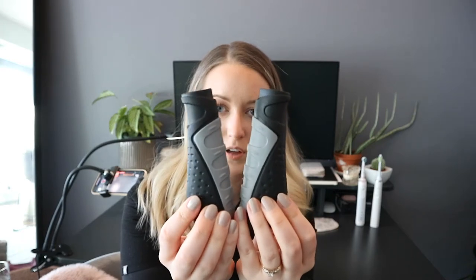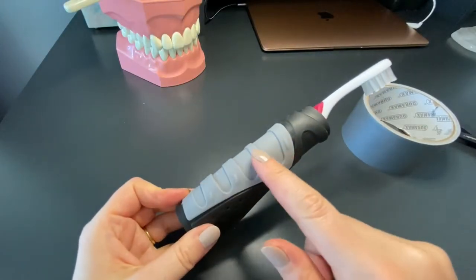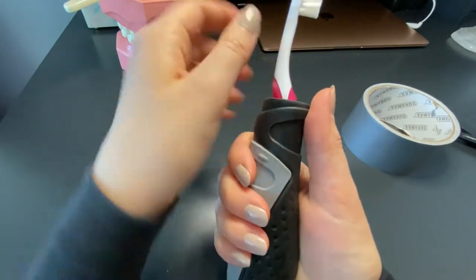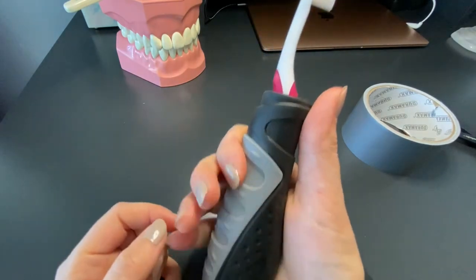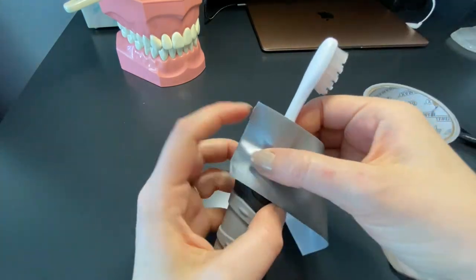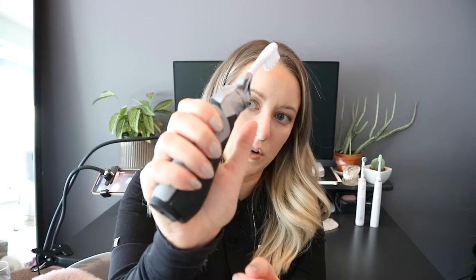Another great thing found at the dollar store are bicycle handle grips. This is perfect — it's made for a hand and you can just take your toothbrush and stick it in there. You might have to tape the top. These grips have places for your fingers already, so you angle the bristles towards your thumb, tape it into place, and match your fingers up to the handle marks. Your thumb goes to the top and you've got a really nice grip to brush your teeth.